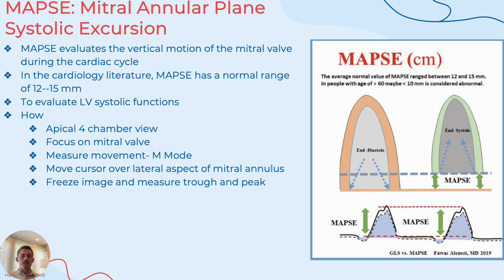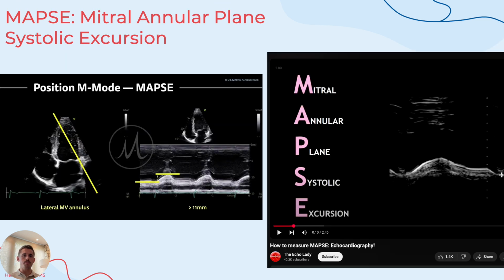And it's important to know that these values can be affected by local wall motion abnormalities that can affect the myocardium near the mitral valve, mitral annular calcification, or a mitral valve prosthesis. So in the same way that in the parasternal long axis view, we had to know about mitral pathologic processes going on so that we could not generalize mitral function to global cardiac function or to left ventricular function, we have to know that here as well.